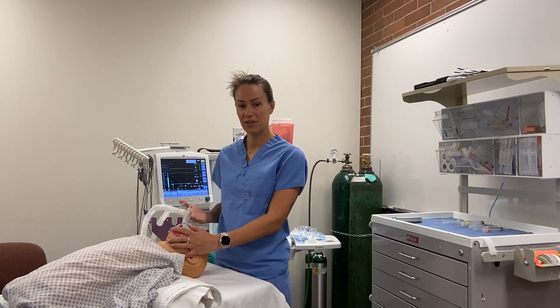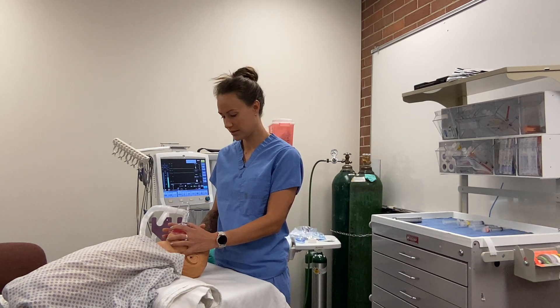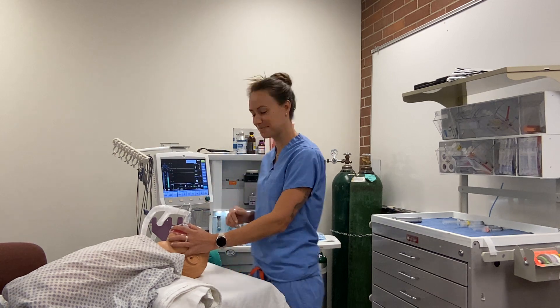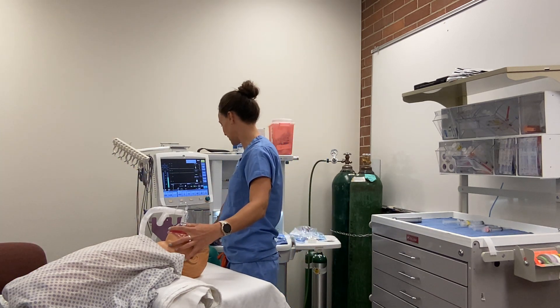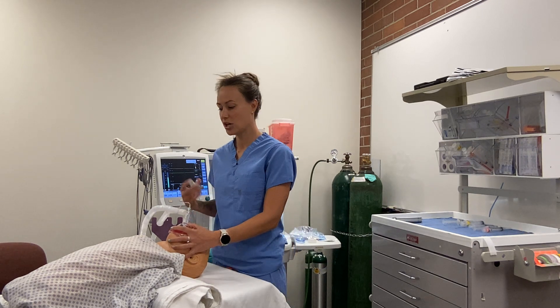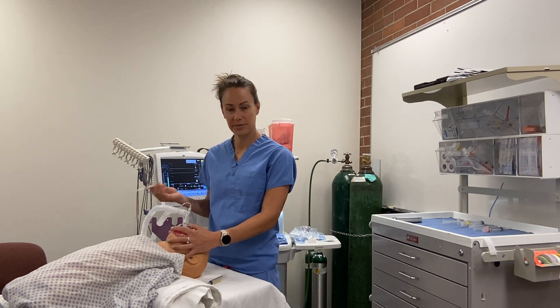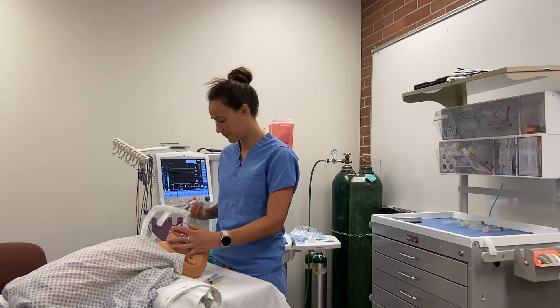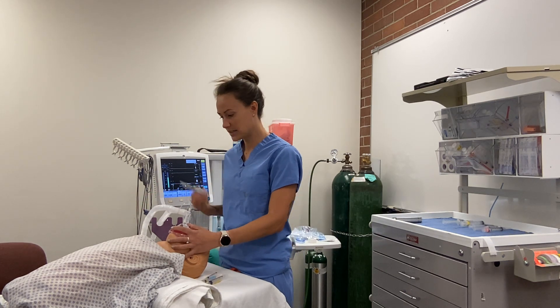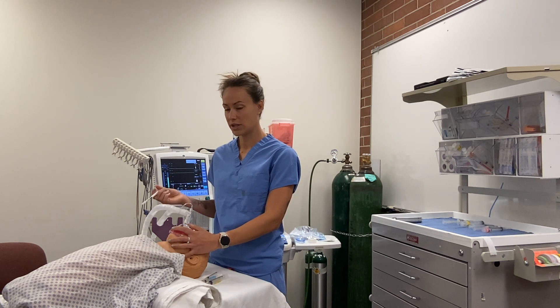Now we can place an IV and proceed. The nurse puts in the IV — great. Now I have my meds. For this patient I'm going to give 2 to 3 mg/kg of propofol, fentanyl 50 mcg, Zofran 0.1 mg/kg, and Decadron 0.0625 to 0.15 mg/kg.